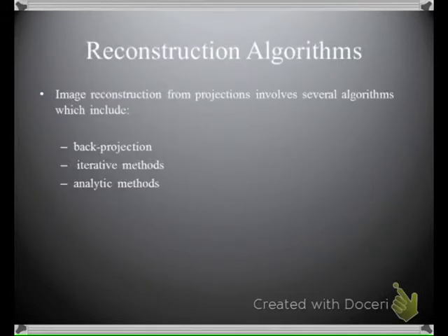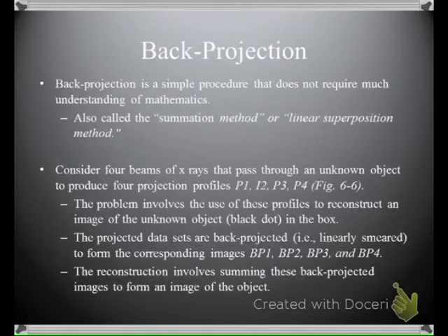So basically, there were 3 types of reconstruction algorithms that were initially constructed. The first is back projection. The second is iterative methods. And the third is analytic methods. And we'll see that analytic methods are what we typically use today for several reasons.